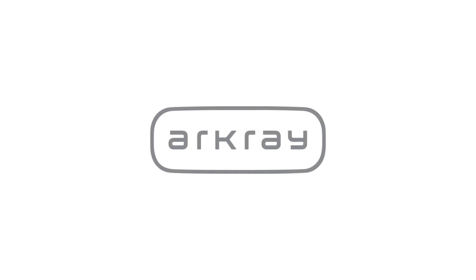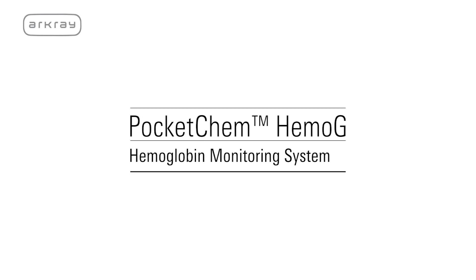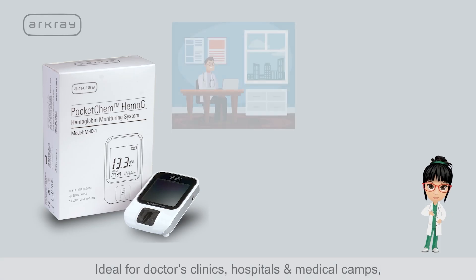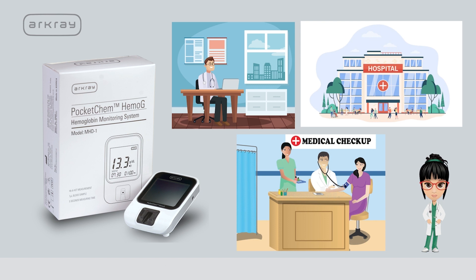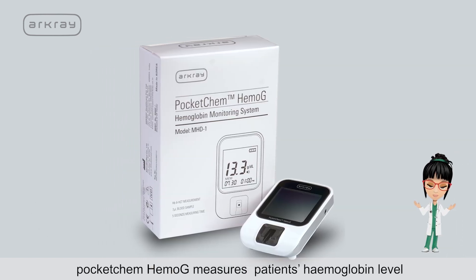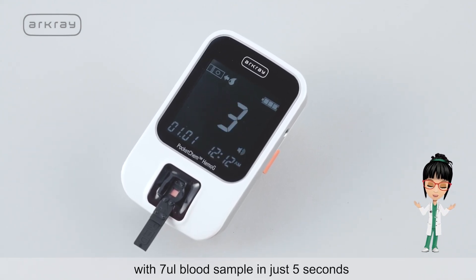Arcre, one of Japan's leading diagnostic companies, brings to you Pocket Chem Hemoji — a quick and easy hemoglobin measuring device. Ideal for doctors' clinics, hospitals, and medical camps, Pocket Chem Hemoji measures a patient's hemoglobin level with a 7 microlitre blood sample in just 5 seconds.